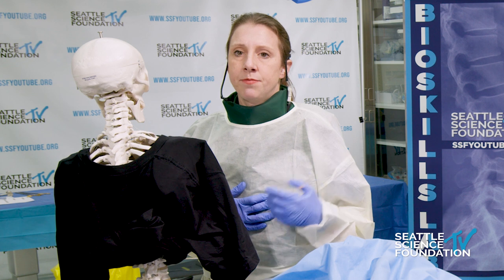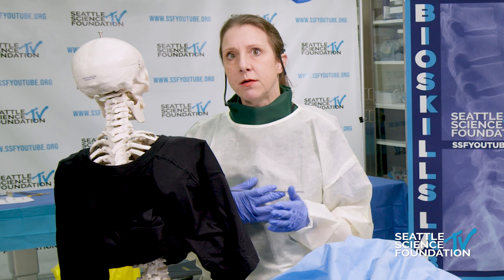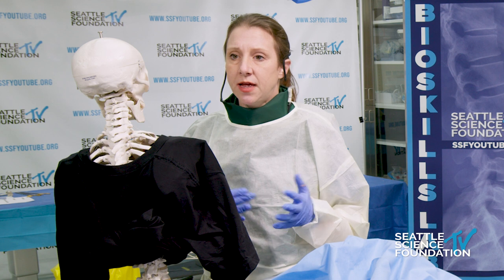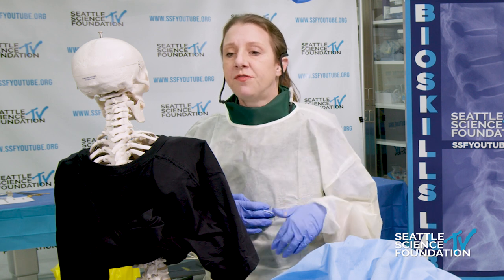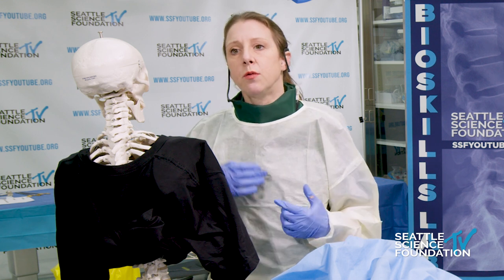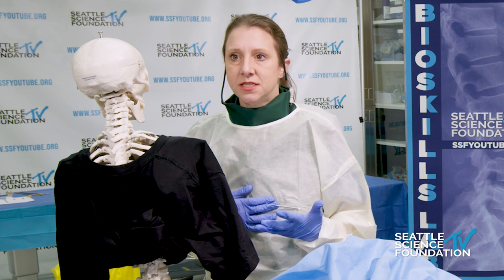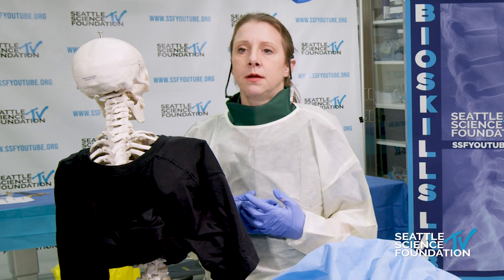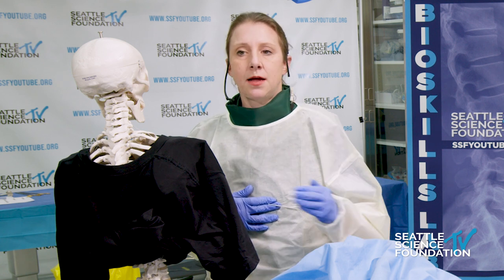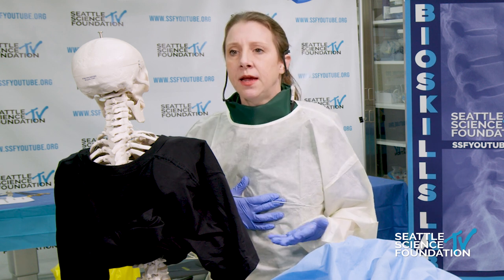If that's the case, with this particular generator, it earmarks or times the number of seconds that have been achieved at the temperature you've programmed before the lesion times out or discontinues. So when you turn or adjust or reposition that needle and then go back to continue that lesion, you can pick up from the number of seconds that you've already completed toward the end of that lesion period, usually in the neighborhood of 85 to 90 seconds.